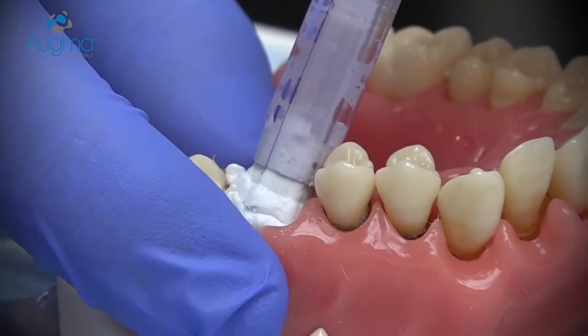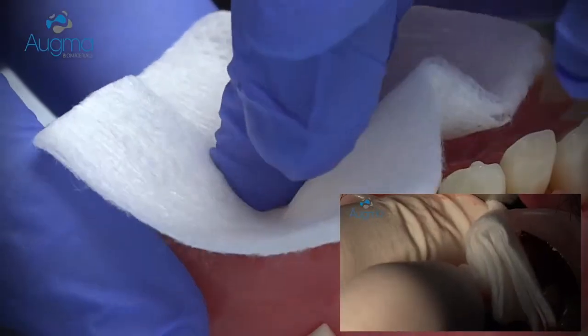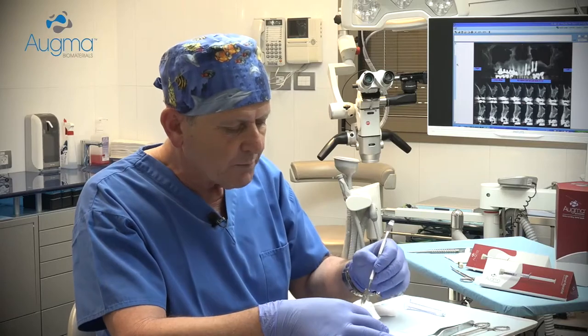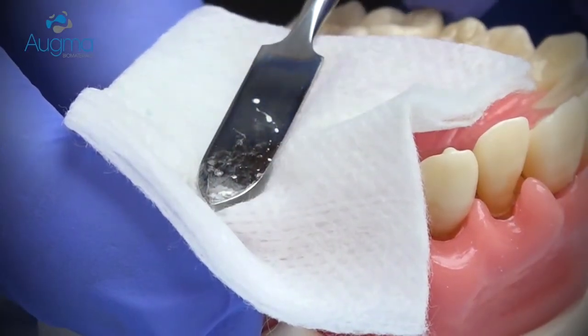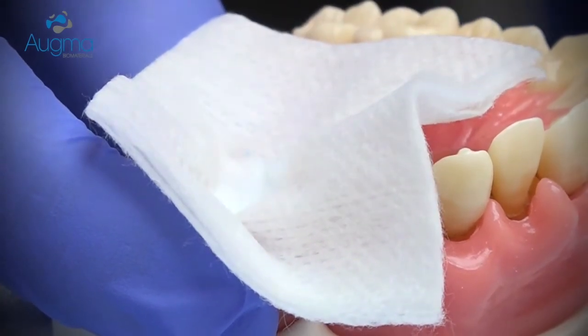Slightly overfill it, and now take a dry gauze and press firmly the material into the socket. If there is not enough place for your finger between the teeth, use a spatula or an elevator and press above the dry gauze.